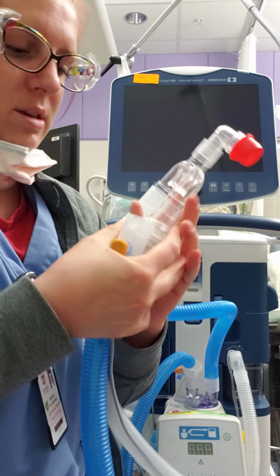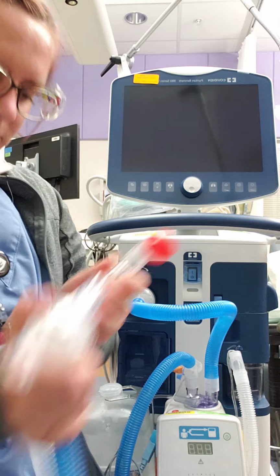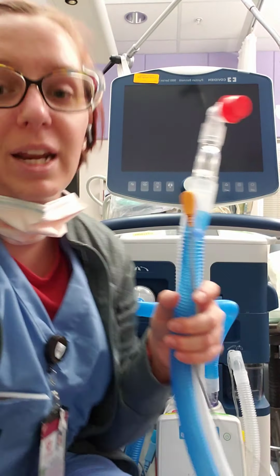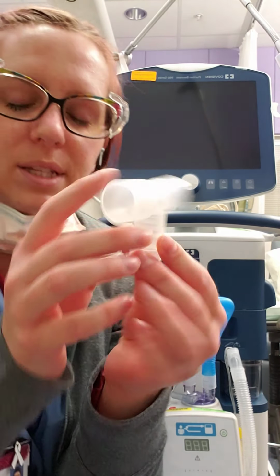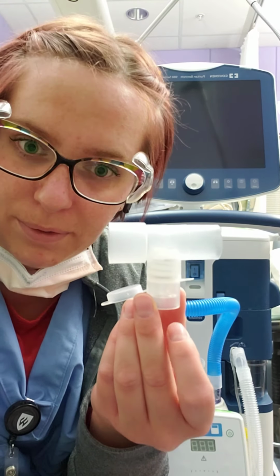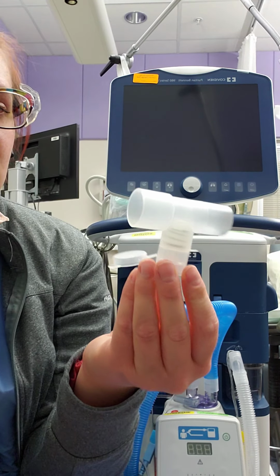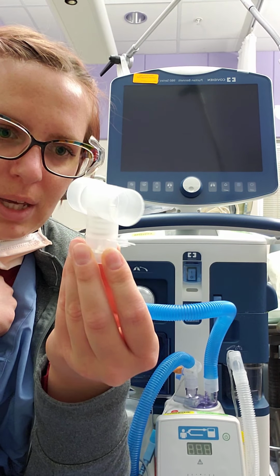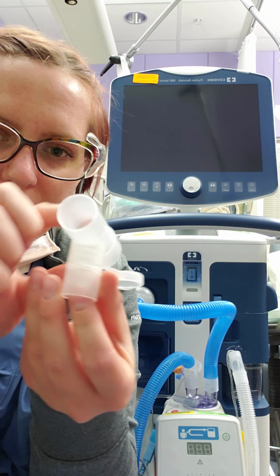Let's say we have an aerosolized medication such as an SVN we need to administer. There's this adapter. It is called a spring T or a T valve. Different companies and different hospitals will call it different things. This is the spring T. As you can see, it goes straight through so that we allow airflow. In here, there is a valve. That one pushed up. Here, you can watch from the inside.